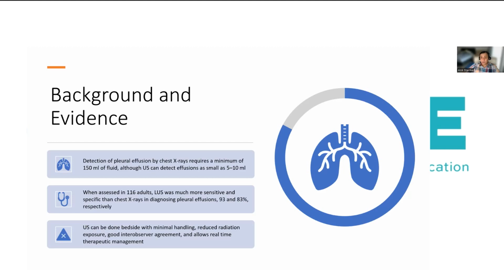The diagnosis of a pleural effusion, without doubt, has good inter-observer agreement. But from my perspective, in a symptomatic baby who might need treatment, it allows real-time therapeutic management.